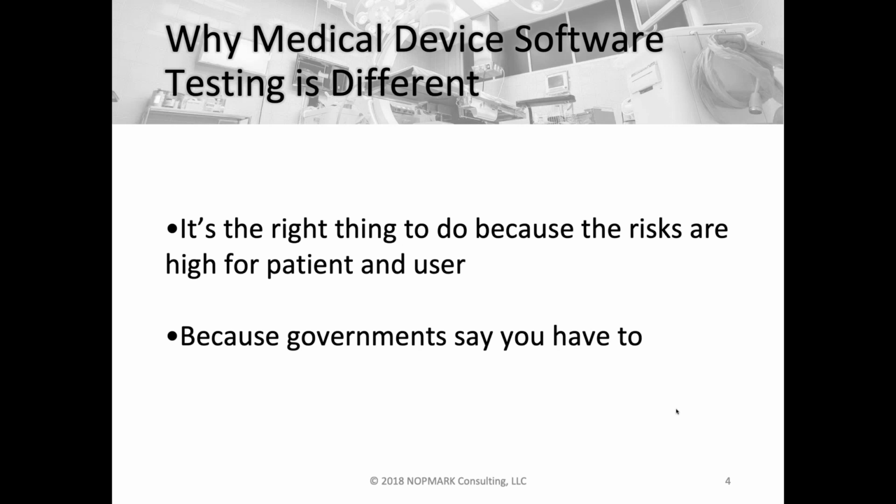So we'll start off with why medical device software testing is different. There are a lot of similarities to testing in other fields, but every domain has something unique about it that drives some different approach that we use for software testing and drives different requirements for our software testing.